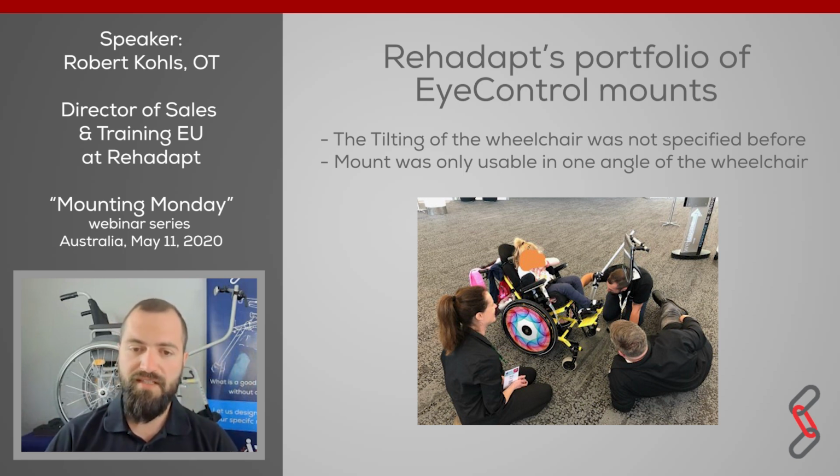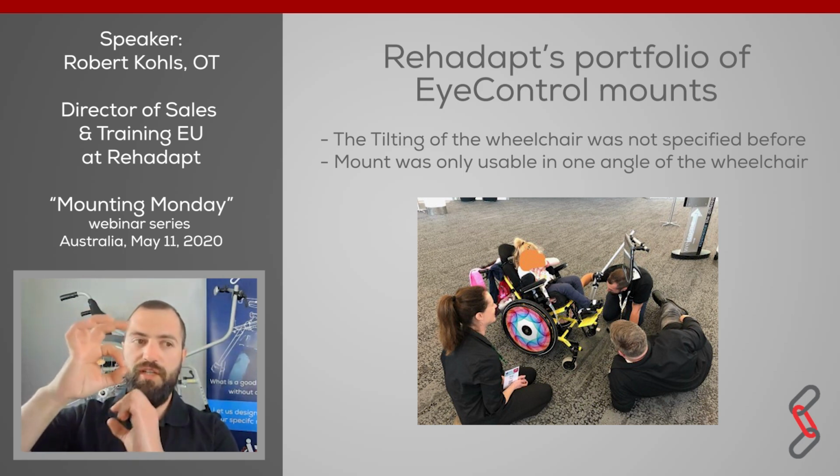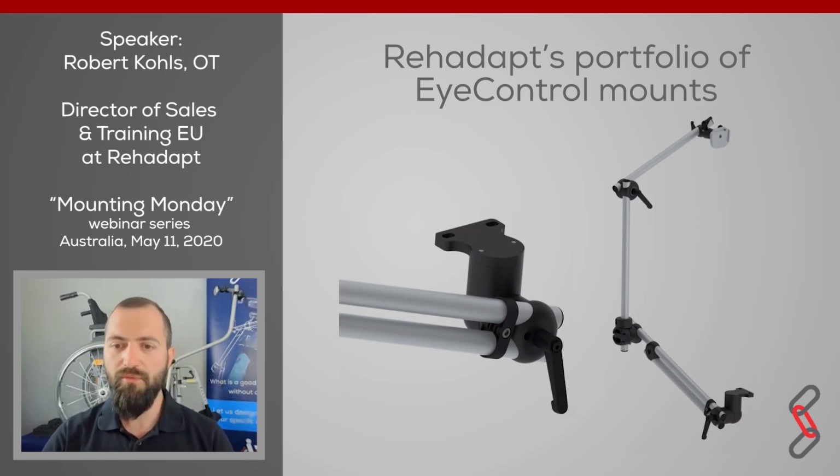So we needed to find a spot on the frame or on the seating plate where we can also attach the HD arm. On the other hand, we also needed a setup where the double tube arm's tubes are over each other and not next to each other. Otherwise, they will not reduce the vibrating effect from the mount.